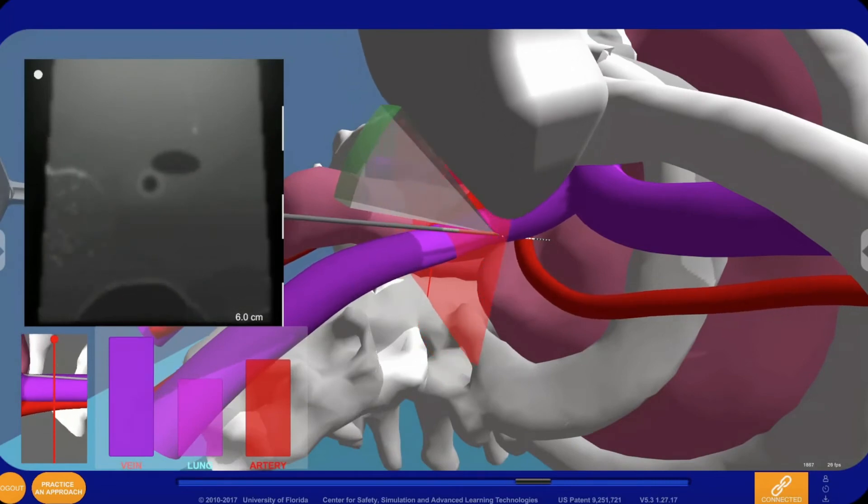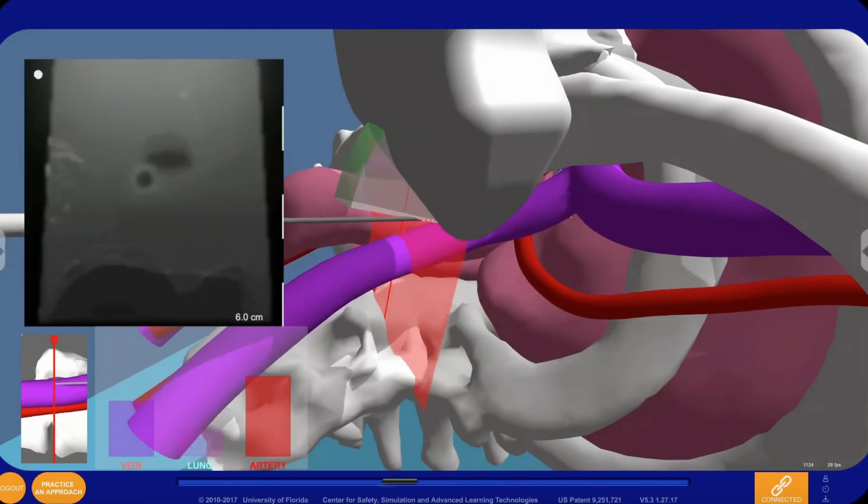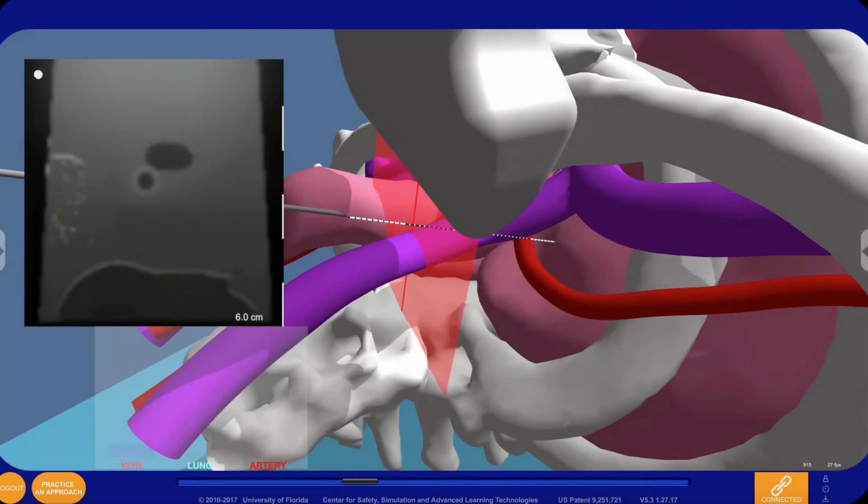This cognitive aid is a proximity monitor. It is a bar graph of how close the needle tip is to the vein, artery, and lung. The closer the needle gets to the structures, the higher the bars rise.